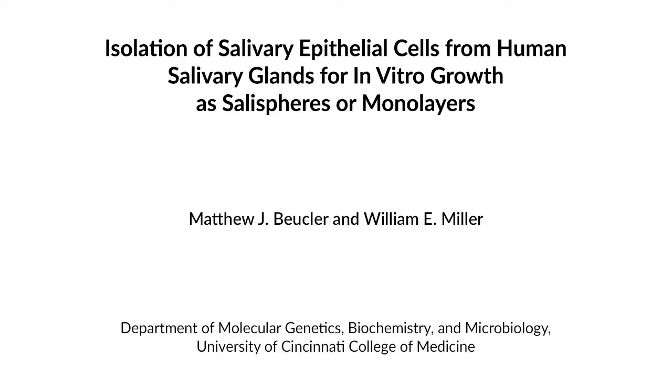Generating primary cellular models or organoid-like structures is key to answering many contemporary questions in biology. For example, we've been interested for quite some time in the mechanisms used by human viruses to facilitate replication in the salivary gland, as it is an important site for horizontal transmission.